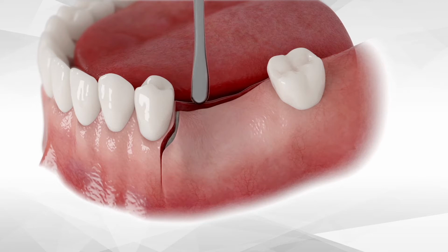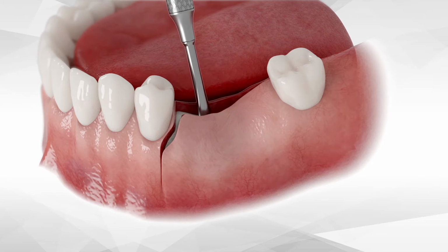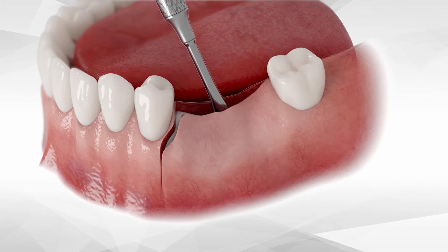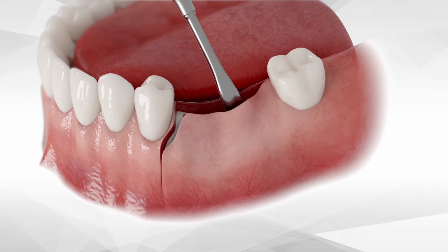Elevate a full thickness flap, but do not exceed by more than 3 mm the reflection into the mobile mucosa. However, in the area of the defect, expose as much as needed in order to see the entire defect and then go back to 3 mm. Note here that the entire defect has to be visualized prior to augmenting.